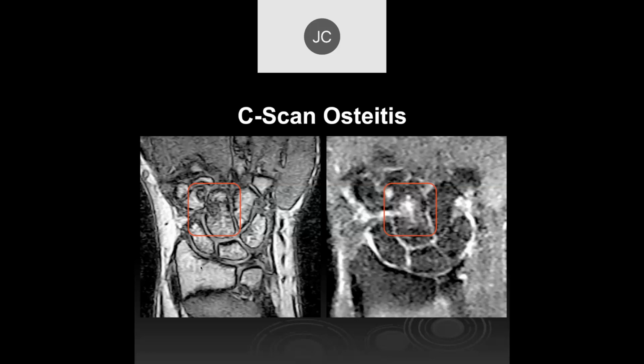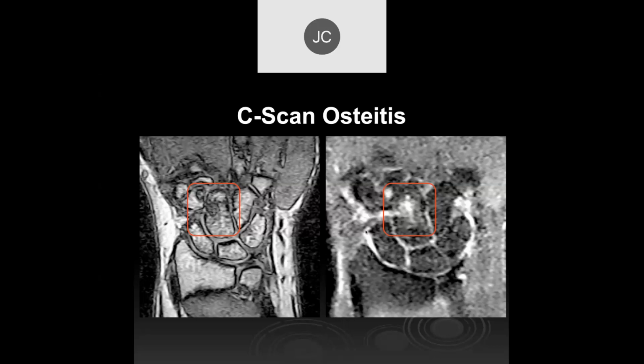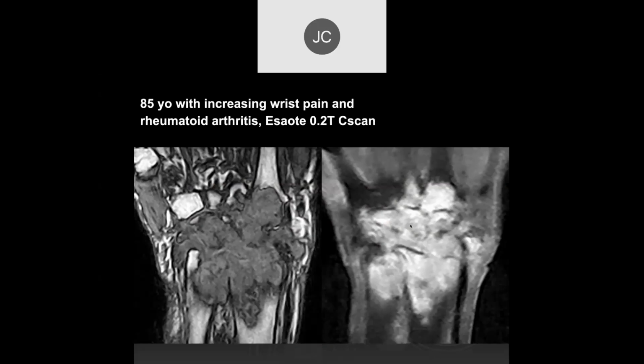Okay. And a lot of people like doing CT for erosions, and that's fine for erosions, but the real pathology here is the inflammatory disease. So I really prefer MR because it's the inflammatory disease you treat rather than the erosions. And you want to try to pick that up before you have actually CT detectable erosive changes, which are irreversible.